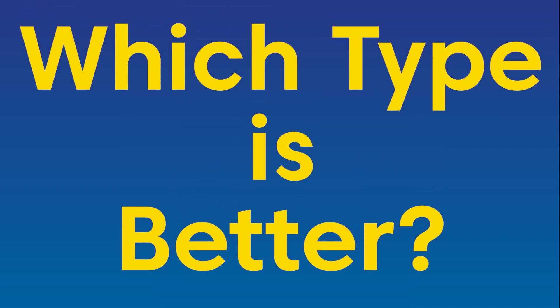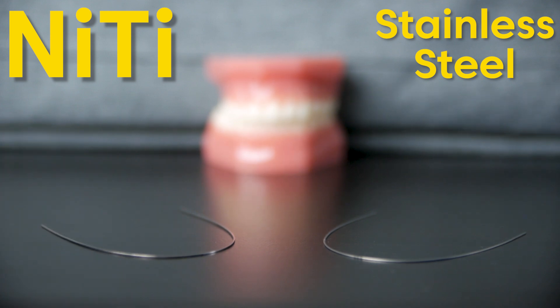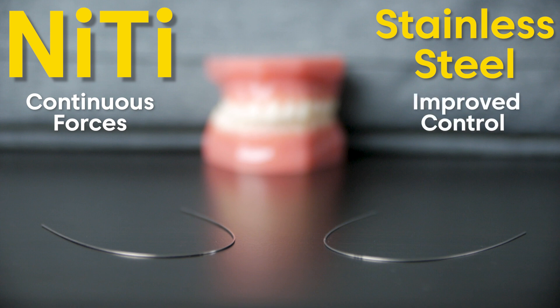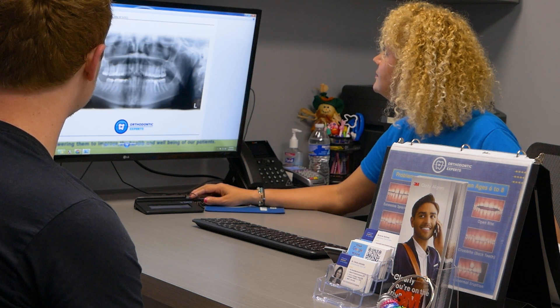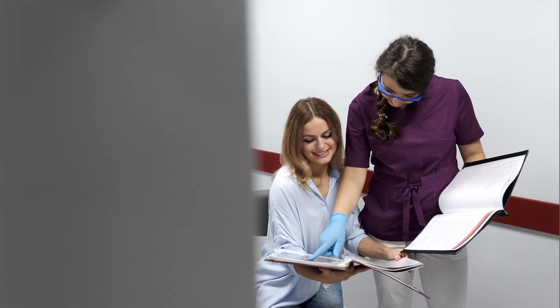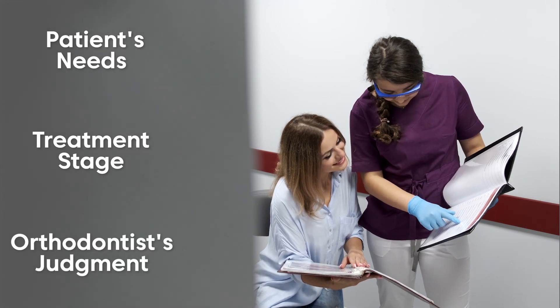Which type is better? When comparing NiTi and stainless steel wires, we can see that both offer valuable advantages that are beneficial for orthodontic treatment. NiTi wires provide gentle and continuous forces, reducing discomfort, while stainless steel wires offer improved control. By combining the strengths of these wire types, orthodontists can customize treatment plans to maximize efficiency and provide patients with a beautiful, healthy smile. It's important to note that the choice between NiTi and stainless steel wires depends on the patient's specific needs, treatment stage, and the orthodontist's professional judgment.